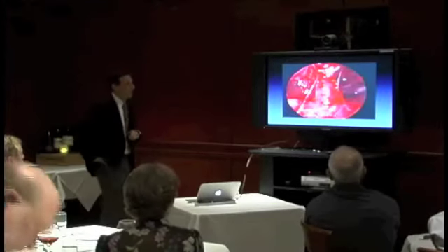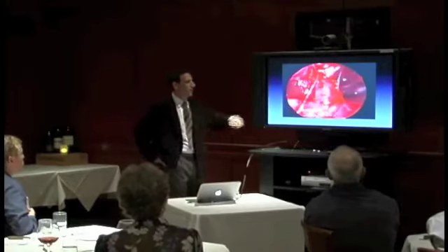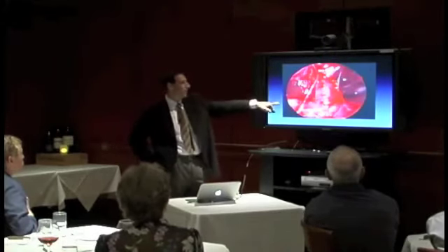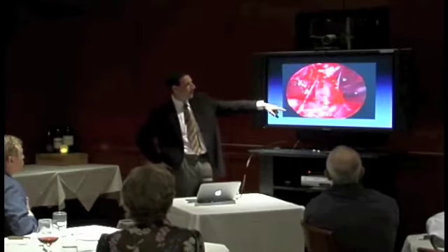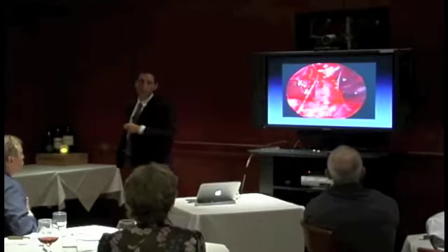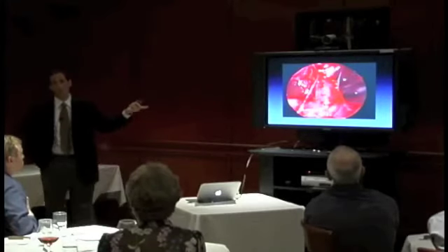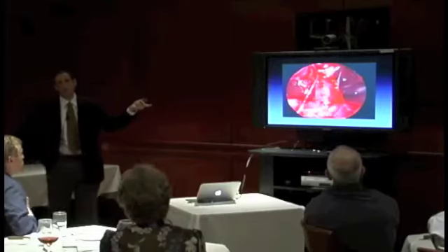The other nice thing is that once you advance the endoscope, you get some beautiful views of the anatomy. Here you see the pituitary stalk. Here's the carotid artery. And you can see in the back corner in that case, you actually can see the third nerve. And the ability to see these things is wonderful because you know that you're not going to injure them if you see them. And you also know that there's no tumor on them.